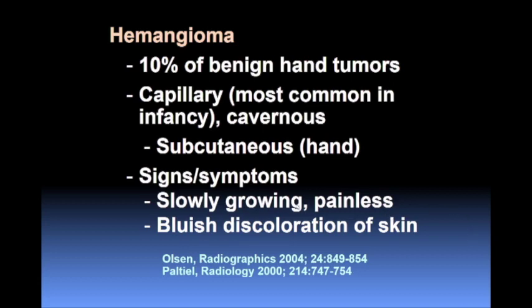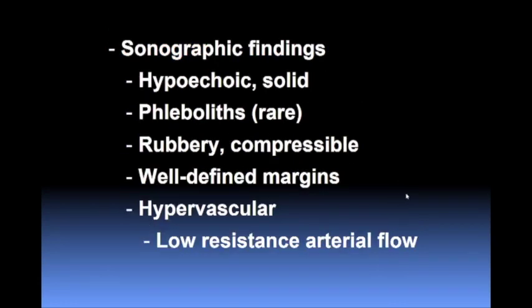And I've seen that a few times, which has helped me with the diagnosis. So again, looking at the location, turning on the lights in the room and feeling it, moving it around, can really be helpful. These two are hypoechoic and solid.